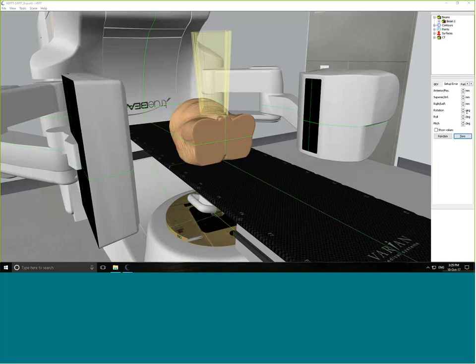So again, I'll put that to the development team. I think the actual process of it is quite easy. It's just the logistics of working out where that would be saved to and how it would be saved, which is the trickier part.